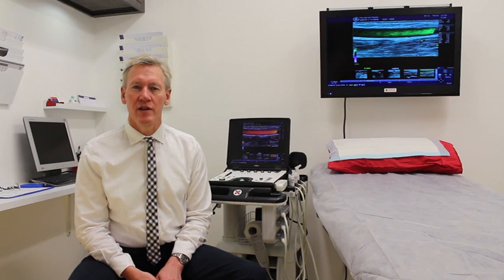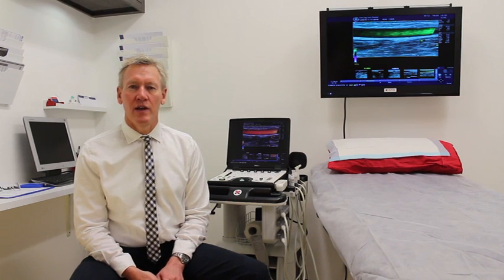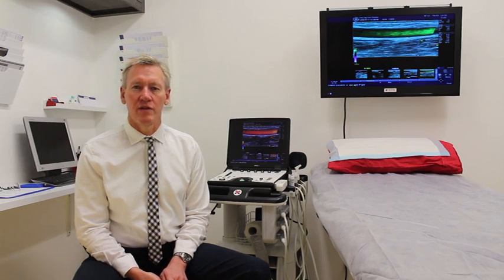And this is where ultrasound is so useful. It not only maps the veins, determines which veins are working, which veins are not working, it allows us to guide our treatment and it allows us to establish whether or not we've been successful in treating the varicose veins.